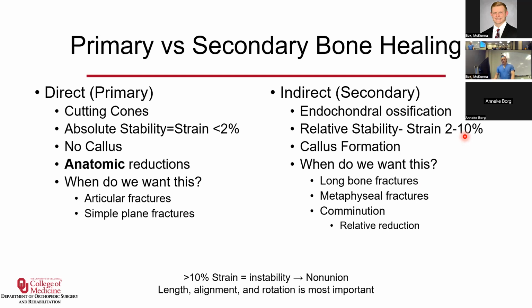So this is used a lot whenever there are long bone fractures, such as using an intramedullary nail, something like this, just a lot longer. Whenever you have a femur fracture, use it with metaphyseal fractures. And if there's a lot of comminution, there's a million pieces, it's hard to put a million pieces together. So you can bridge it, stabilize it, so then a callus can form and it can heal.